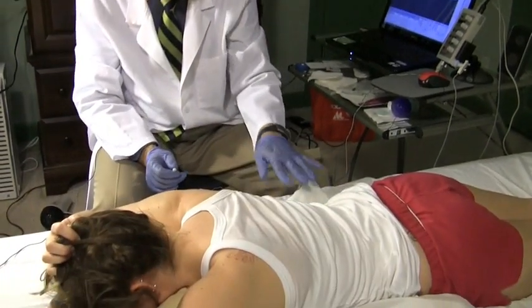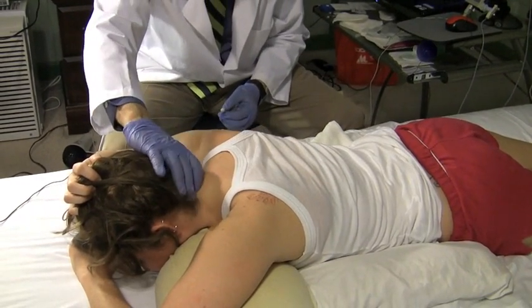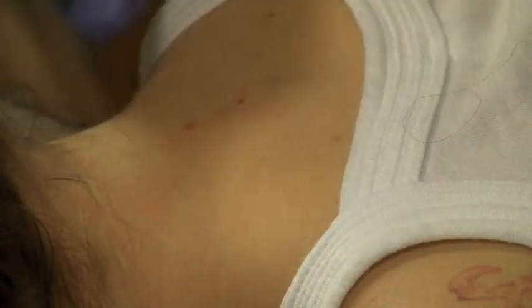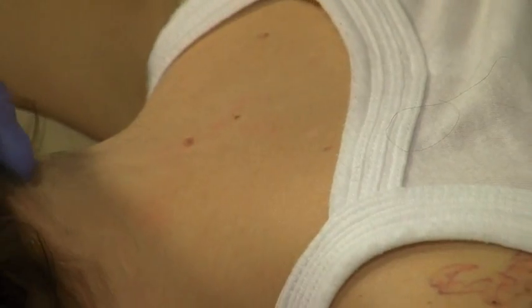And now we're going to do the cervical paraspinals. I've wiped it up with alcohol already. Those are not easy to relax, so I have the subject hang their head over the pillow.